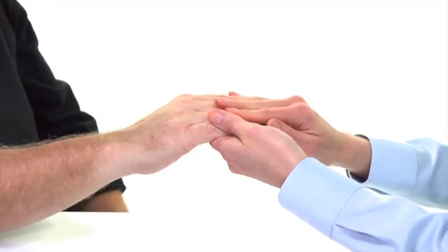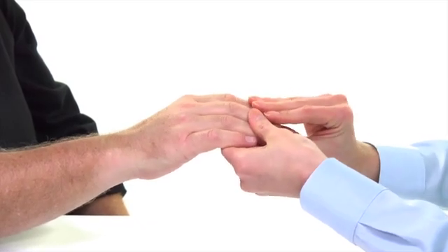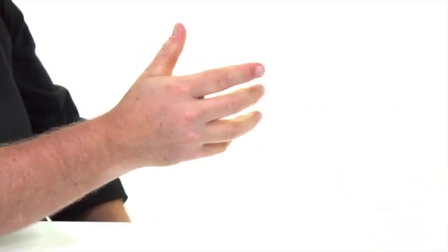If the hand has been grasping a rail or other object, or if it is cold, relax and warm the hand to restore stronger blood flow.